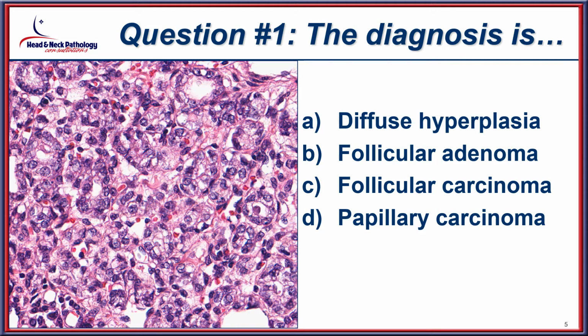Having just seen that slide, I hope that you were able to come up with a diagnosis, and reviewing all of the histologic features, I do hope that you considered this to be a papillary carcinoma or potentially one of the variants that we are going to be discussing today.